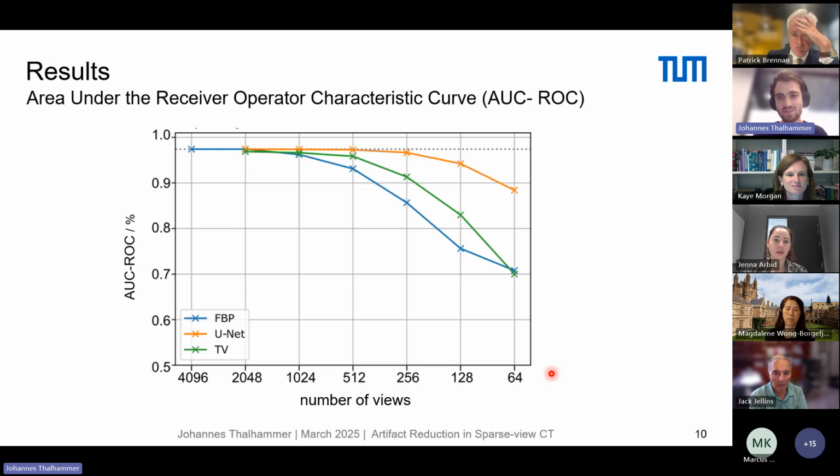So basically, the network outputs a number between 0 and 1. And then to get a binary classification, so hemorrhage, yes or no, you define a threshold. And then when you just go through the threshold, you get different specificities and sensitivities. And you get kind of a curve. And then you can just calculate the area under this curve, and higher basically means better performance.